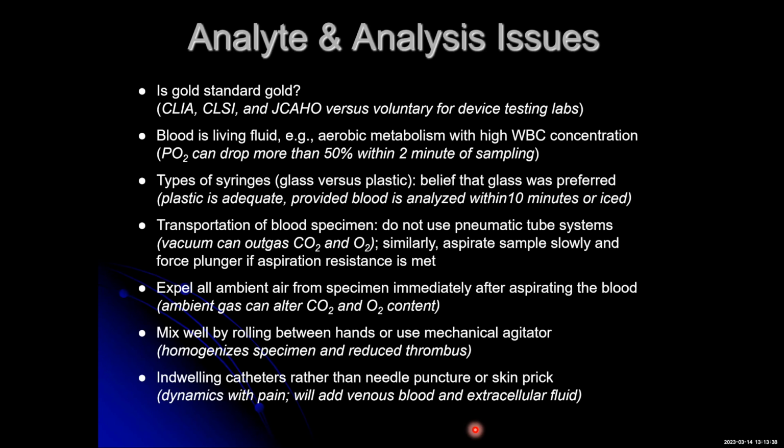Now, there are a variety of actual standards beyond the ISO standard, but they're referenced within ISO about making sure that you're doing this sort of thing correctly. So even if you're doing convenience sampling, the device has already collected enough information for submission of accuracy, but FDA or other regulatory bodies are saying, give us some clinical evidence that this thing is appropriate in a use case for a particular population.